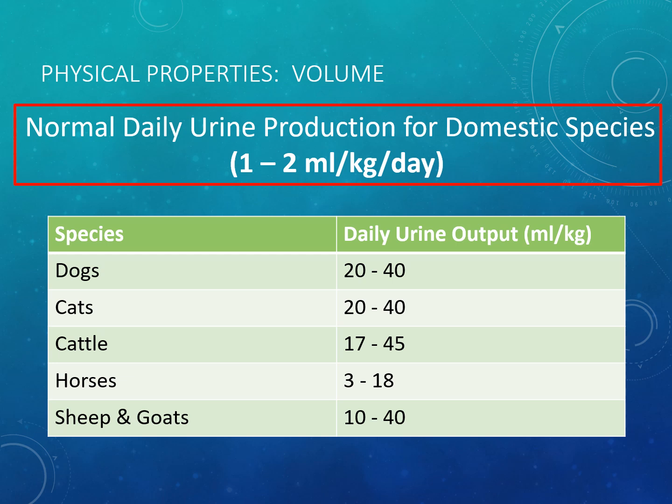This is especially important with animals that are in renal failure. You want to make sure that their kidneys are producing urine, or obstructed animals. And we can measure the amount of urine in a catheterized animal, for example. We can measure the IV fluids that we're giving them, and then we can also measure the fluid that they're producing that comes out in the bag.